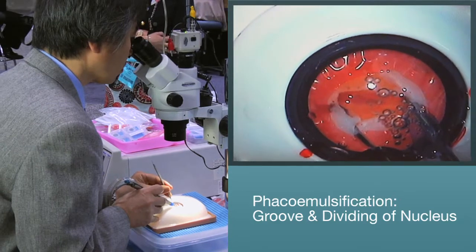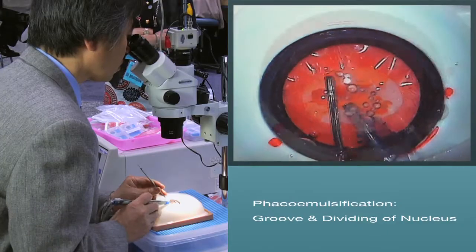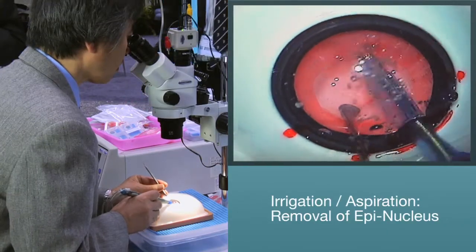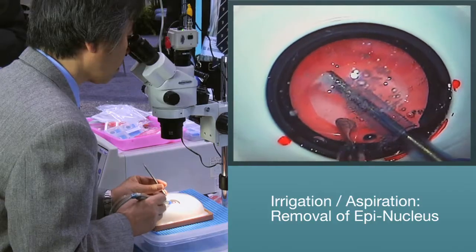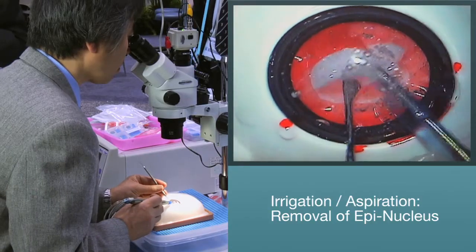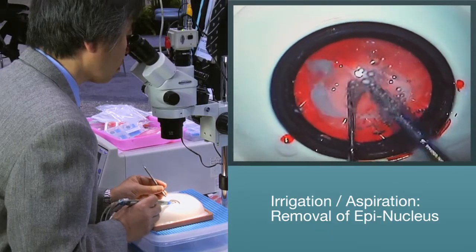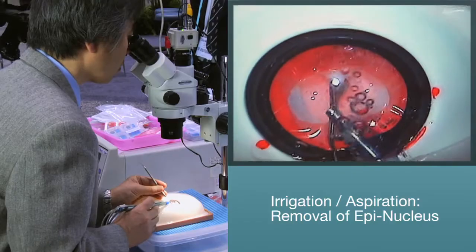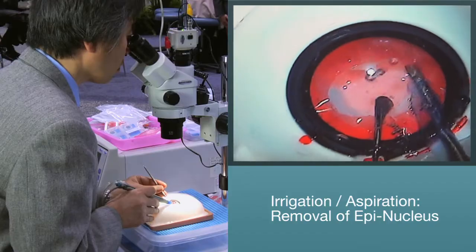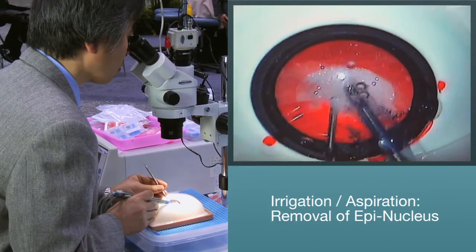Once the nucleus is completely removed, you can move on to the removal of the epi-nucleus. With the Kataro system, you can use an IA handpiece only when practicing with the soft nucleus. When using a medium or hard nucleus, continue to use your phaco handpiece. Note how the epi-nucleus peels off from the posterior capsule — another realistic feel for the surgeon. Once the epi-nucleus has been completely removed, you are ready for IOL implantation.